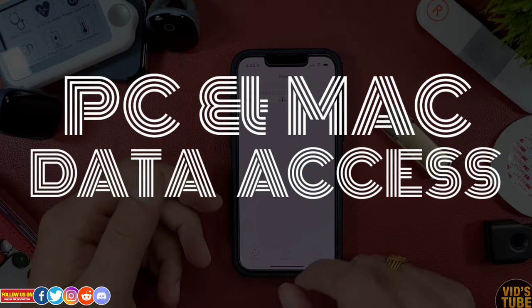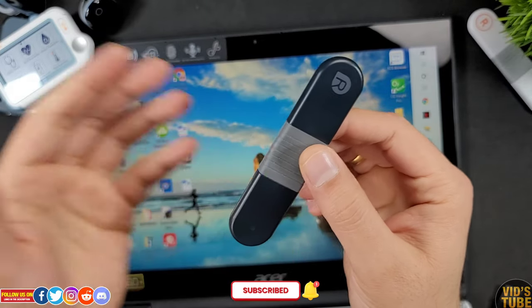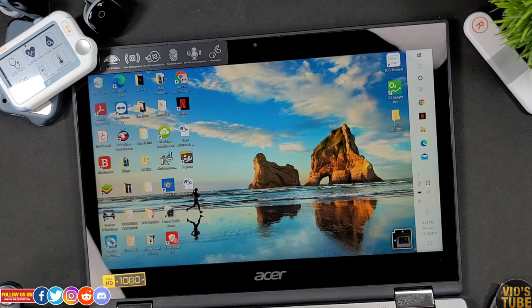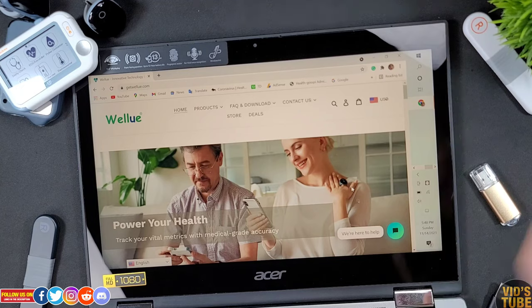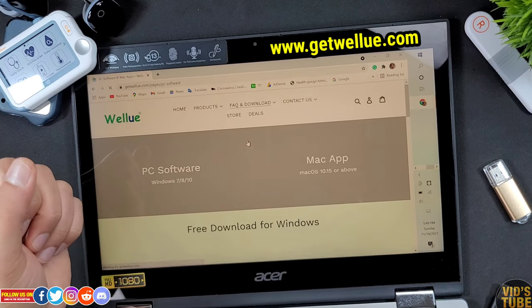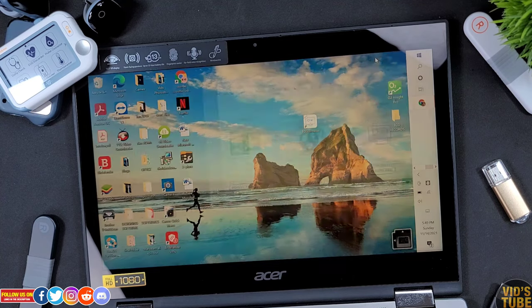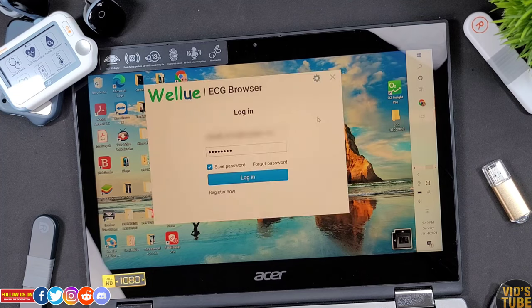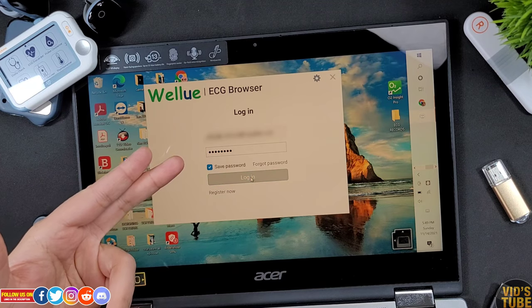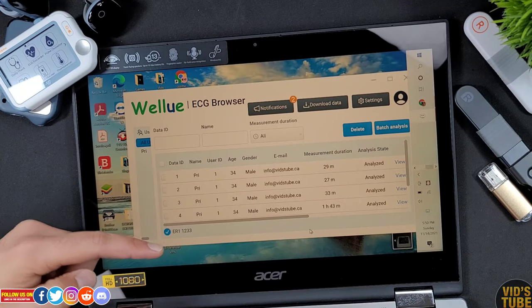Now let me show you how to access the data from a PC or a Mac. For this video, I will connect this AI ECG recorder to my Acer laptop. You will need the ECG browser app to access and read all the collected data. You can install this ECG browser app from the included USB flash drive or from getwellue.com — under PC software downloads, you will find ECG browser version 1.1.0. Once installed and opened, you will need to create an account. Then attach the charger into the USB port of your laptop or Mac and you should see the ECG recorder connected.